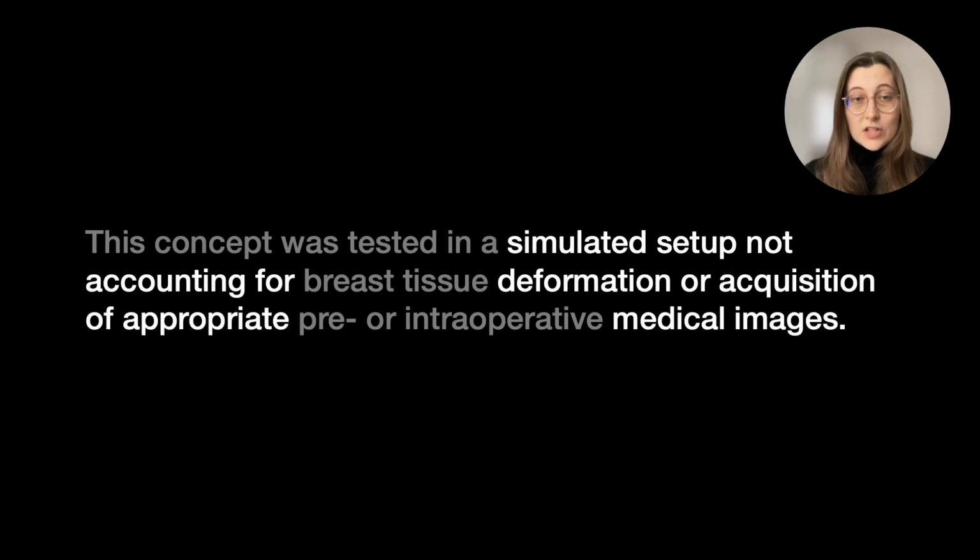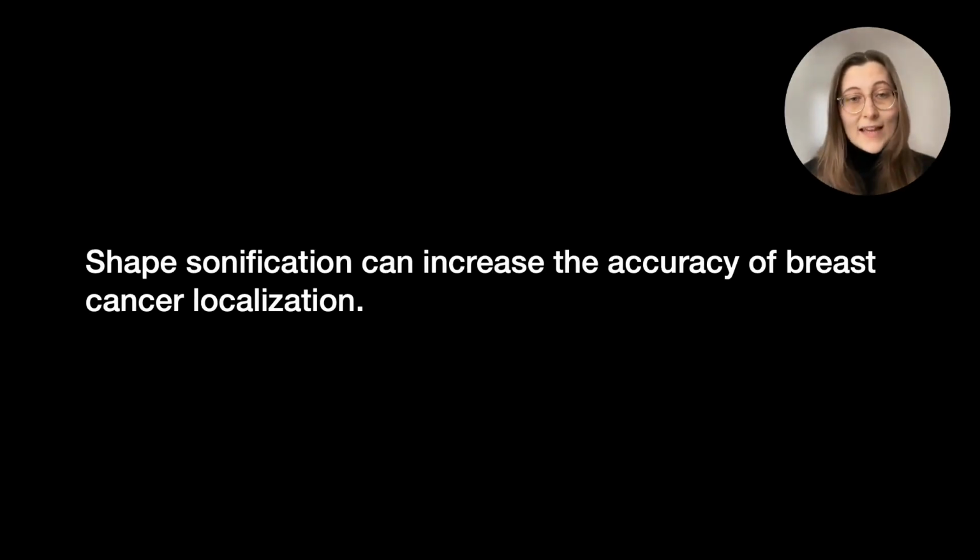Of course, our studies do not come without limitations. This concept was tested in a simulated setup, not accounting for breast tissue deformation or acquisition of appropriate pre- or intraoperative medical images. Consideration of these topics would be key to achieving application of this concept in clinical practice. Nevertheless, we provide evidence that shape sonification can increase the accuracy of breast cancer localization.